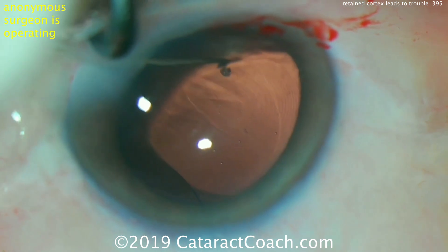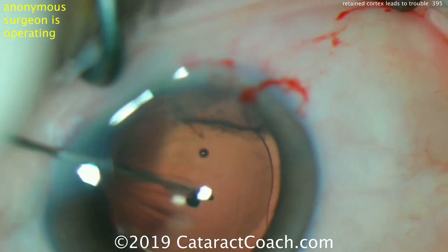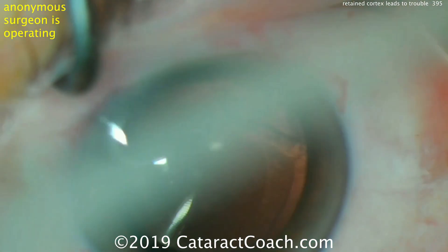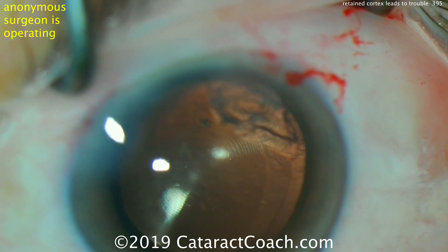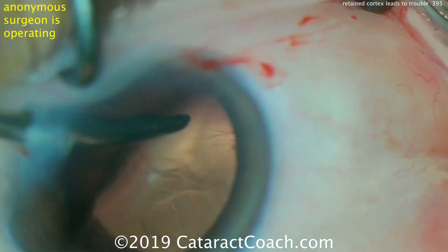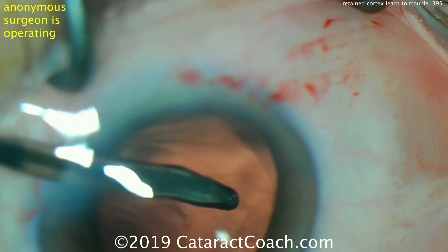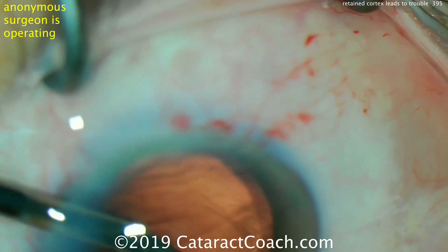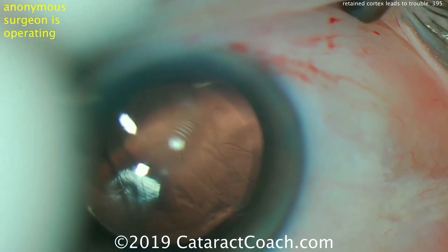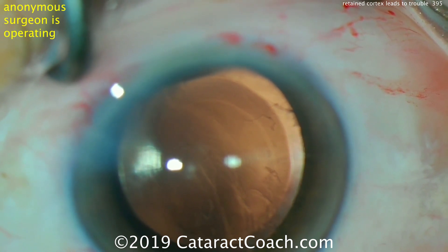If there is a large bit of cortex left, this can cause a lot of inflammation in the post-op period, which can predispose the eye to issues like macular edema. Cystoid macular edema often occurs in the setting of a pre-existing epiretinal membrane — and remember, in important studies by Don Gass, 20% of 70-year-olds have a pre-existing epiretinal membrane. Here we're removing lens cortex now released by friction from the IOL rotation, but there's still some lens cortex remaining — directly opposite, now more difficult to get because it's behind the IOL.